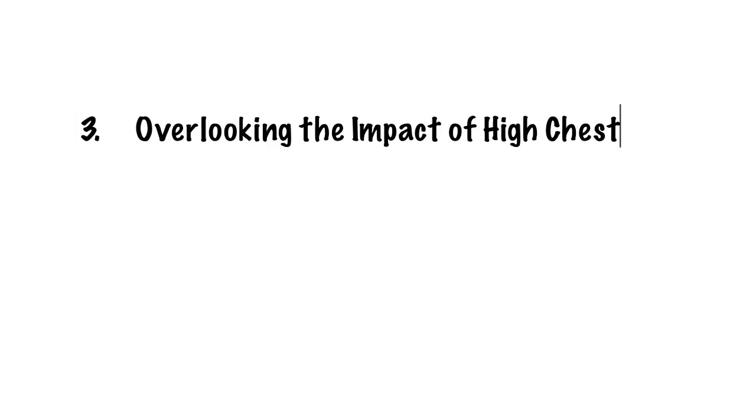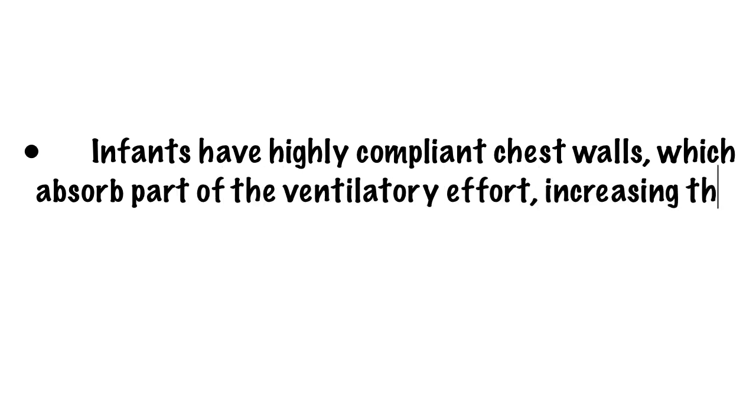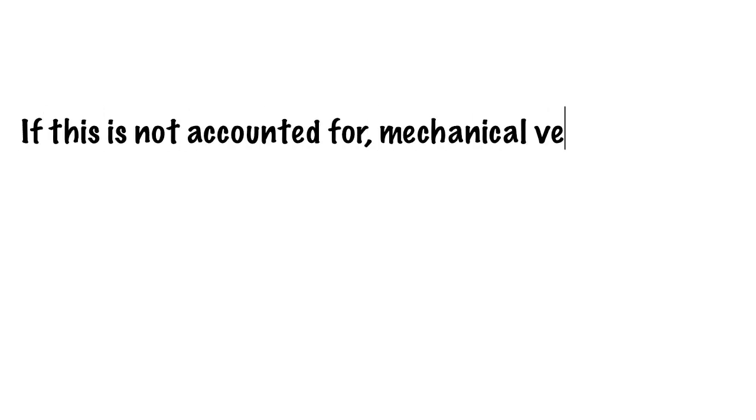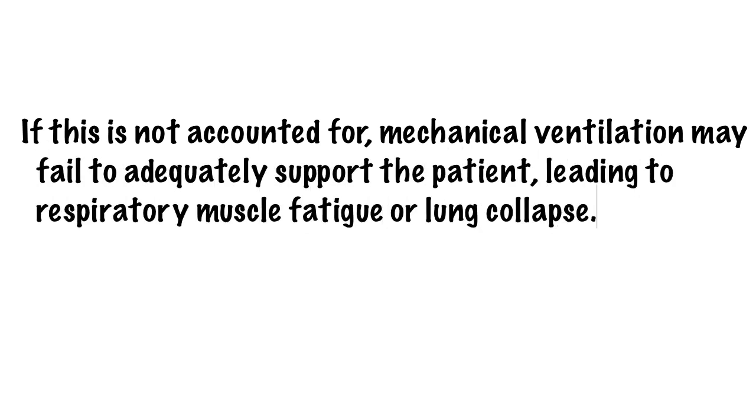3. Overlooking the impact of high chest wall compliance. Infants have highly compliant chest walls, which absorb part of the ventilatory effort, increasing the work of breathing. If this is not accounted for, mechanical ventilation may fail to adequately support the patient, leading to respiratory muscle fatigue or lung collapse.